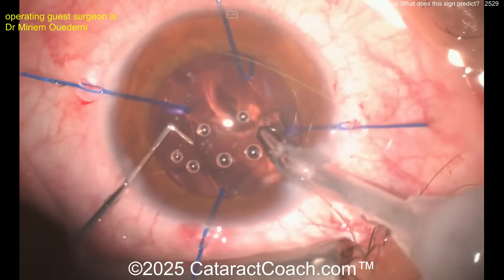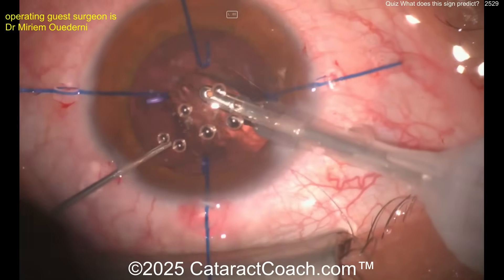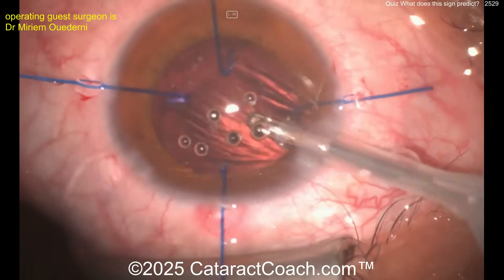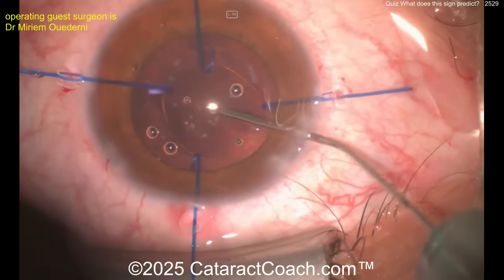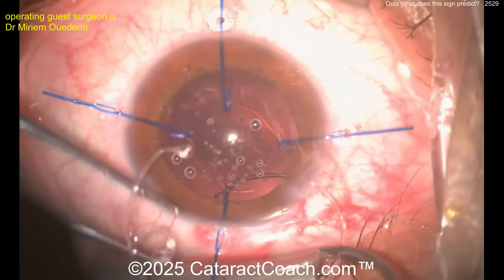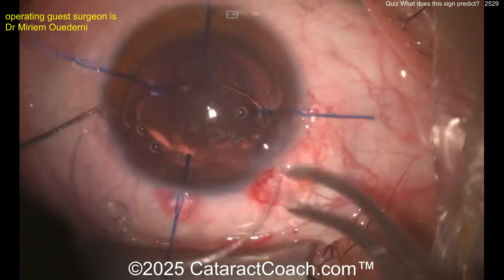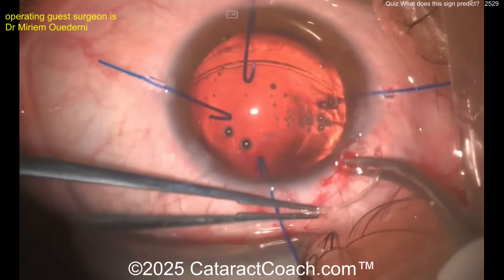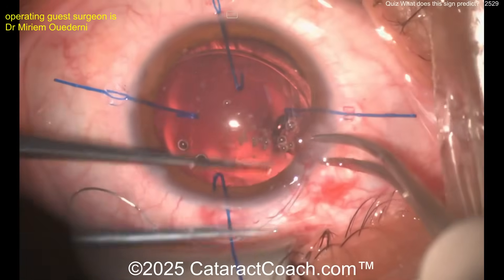There's some cortex — be careful because you only have these four points of fixation. Going through your mind you must think: how are we going to secure the IOL and the capsular bag? I like this idea — don't let the bag collapse, inject viscoelastic in the bag. A capsular tension ring with an eyelet — a Cionni ring — is being delivered, and you can see it has that extra eyelet to which the surgeon has already threaded a polypropylene suture. Get this in the bag nice and easy.